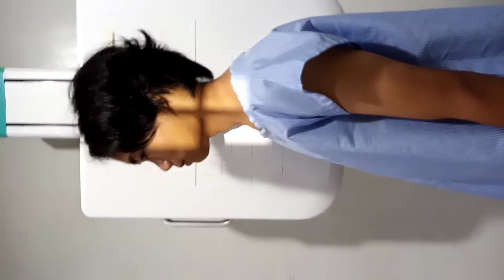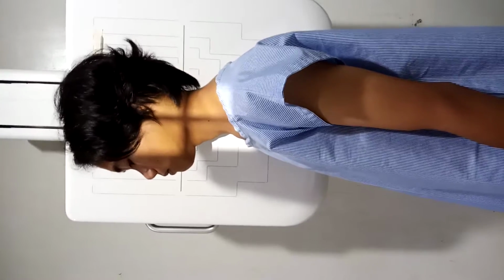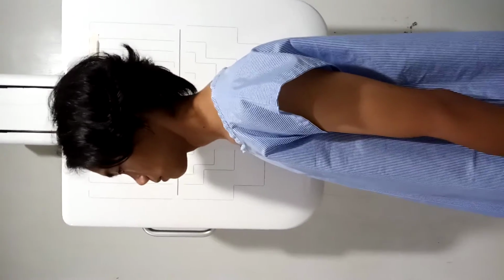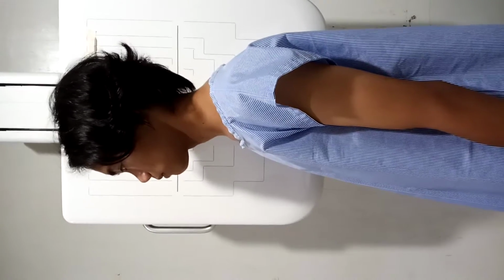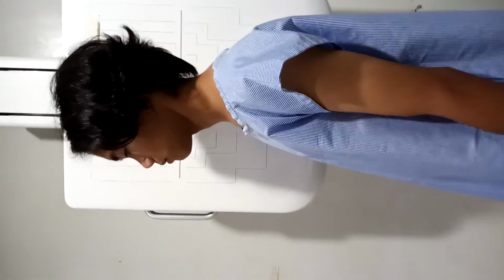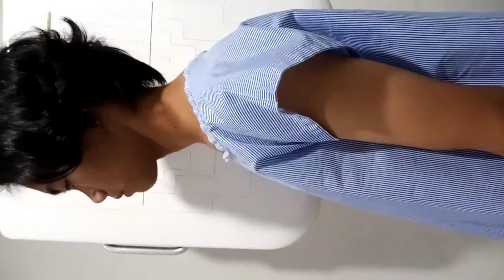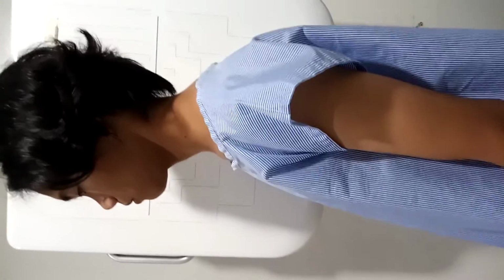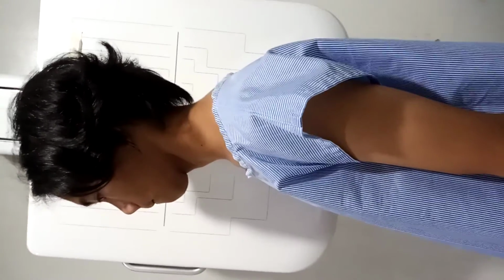The rami or the ramus of the mandible do not superimpose C1 to C2. Then in exposure, the soft tissue margins, including margins of the trachea, and the bony margins and trabecular markings of the cervical vertebrae must be clearly demonstrated. Thus, there should be no motion seen in the radiograph.